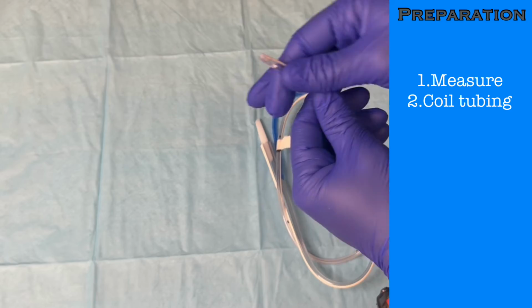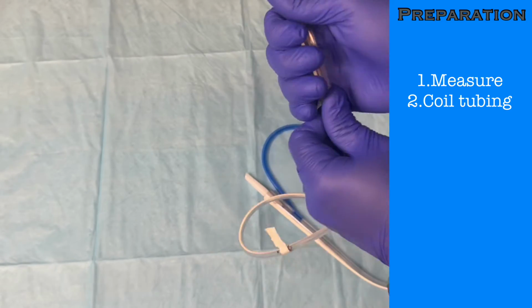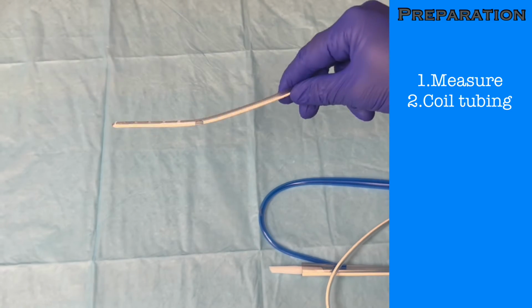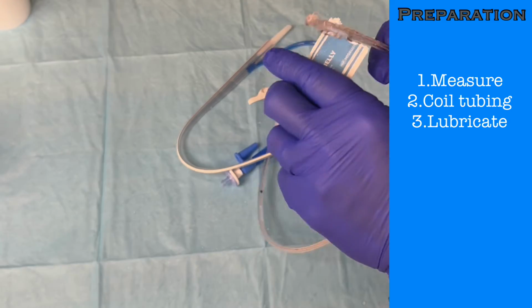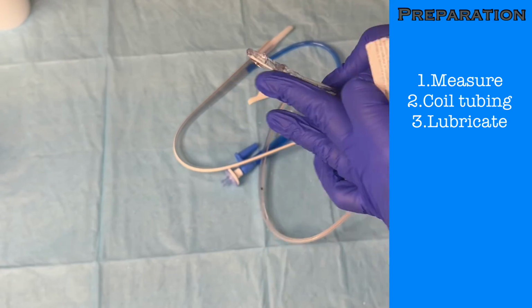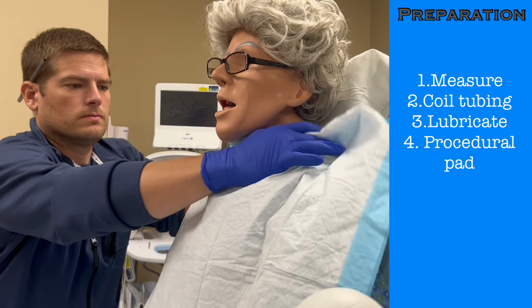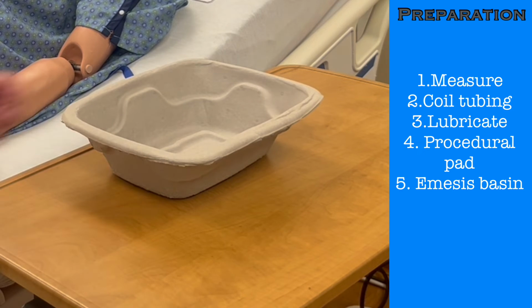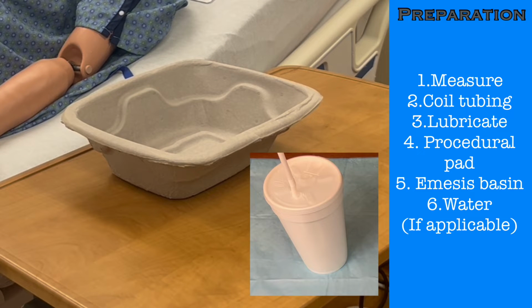You can coil the first 8 inches or so around your hand to give the tip of the tubing a bit of a curve, and the heat from your hand will help the tube gain some flexibility. Heavily lubricate the end of the NG tube. Place the procedural pad over the patient like a bib, and either give the patient the emesis basin or keep it close by. If the patient is able to swallow, have a cup of water with a straw ready.